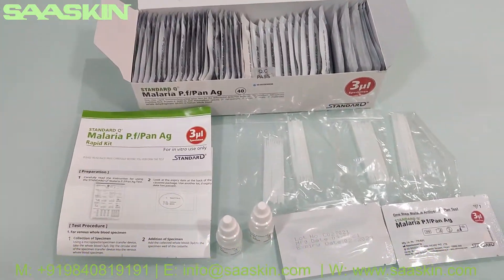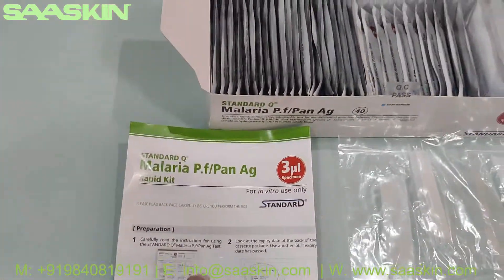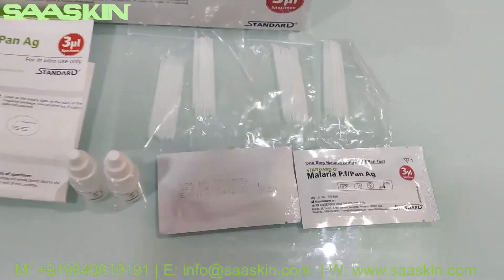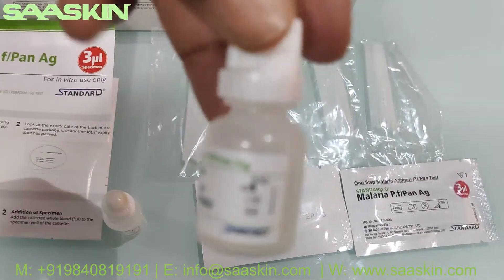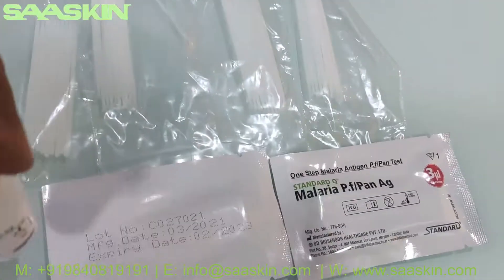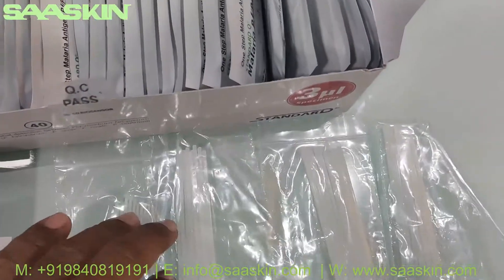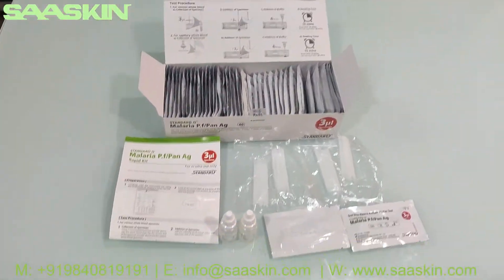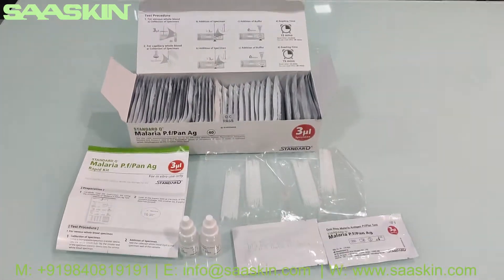The Standard Q Malaria PF Pan Antigen Test Kit box, which is a 40 test kit box, contains an instruction manual, 2 buffer bottles of 3ml each, 40 specimen transfer devices, and 40 test cassettes. This is how the Standard Q Malaria PF Pan Antigen Test Kit box looks like. So this is the unboxing for you. Thank you.